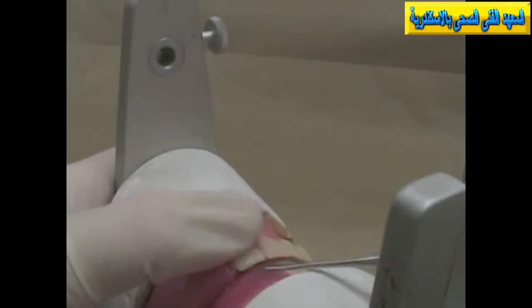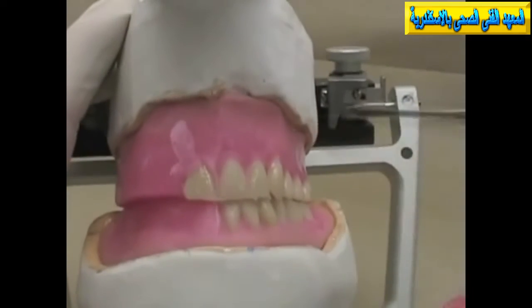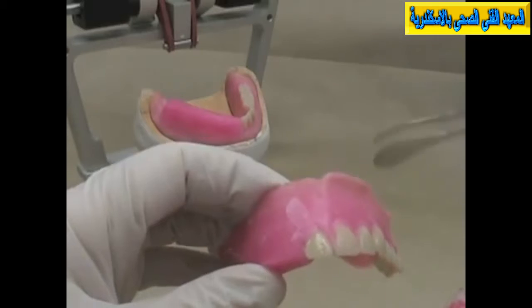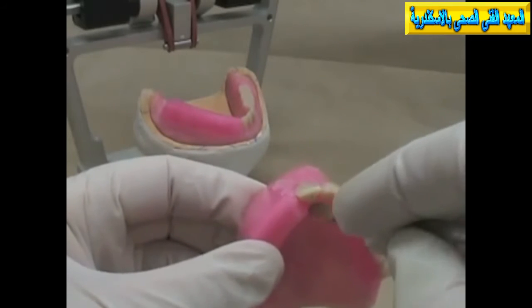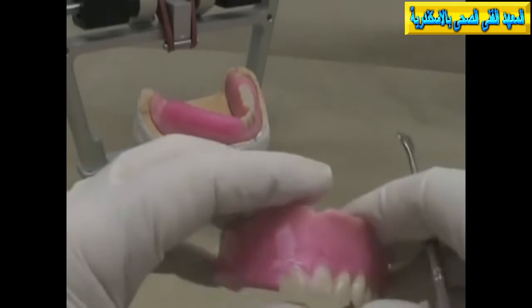and take a look and see how it relates to my ridge below here, because again that should have been contoured properly as well. And you can see I can just use my instrument here to sort of pry it apart so that the overjet looks approximately the same as what it does on the opposite side. Watch that your incisal edges are relatively flat and make sure that you don't end up with a diastema as you see here. So I've got the tooth close to where I want it to be. I'm just going to soften up the wax a little bit more, move it closer to the other central incisor, and straighten up the incisal edge a little bit.